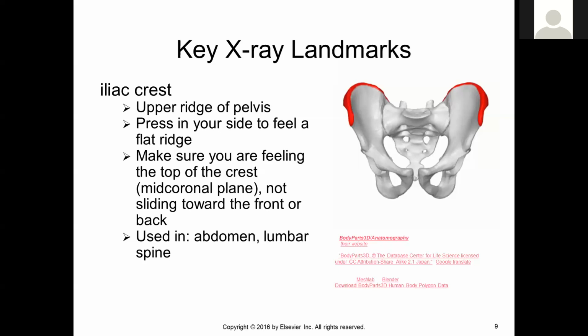So you want to be right in the mid-coronal plane. So as if you were being cut from front to back, directly in the center, kind of where the armpit plane is, the mid-axillary line. Press in with your thumb, you will feel a flat ridge. So you don't want to slide forward or backward. You want the crest itself, the top of the crest, directly midline of your patient.